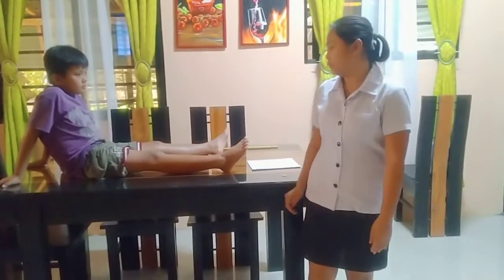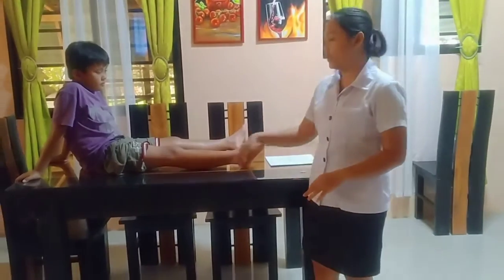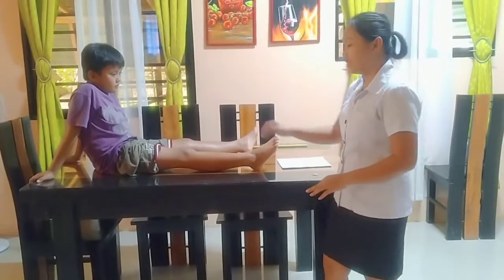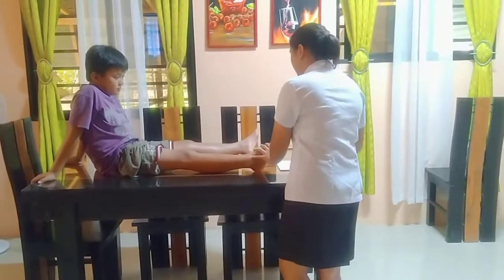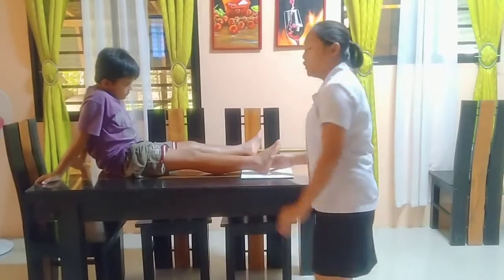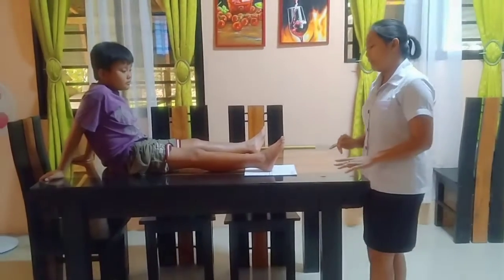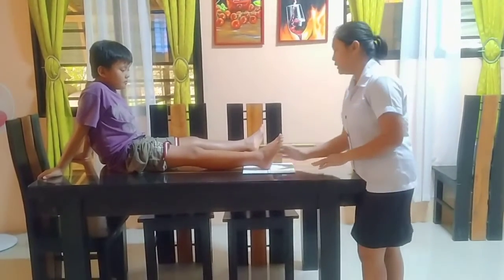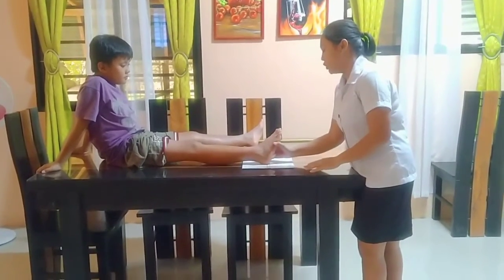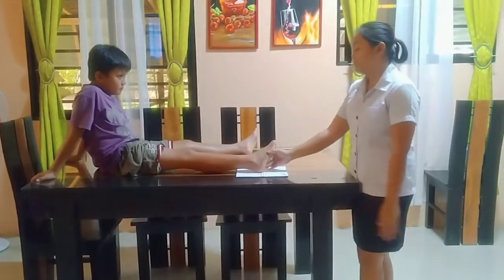Now, the first projection will be the apiaxial oblique medial rotation of the foot. First, instruct the patient to be in seated position or in supine position. Now, extend the limb. Ensure that the subtalar of the patient is at the center of the IR. Now, since may axial po ang ating projection, we will be rotating the feet of the patient 30 degrees medially.